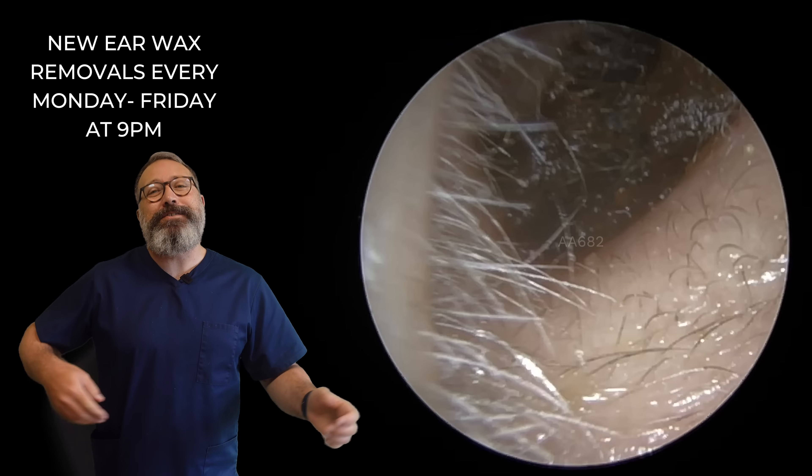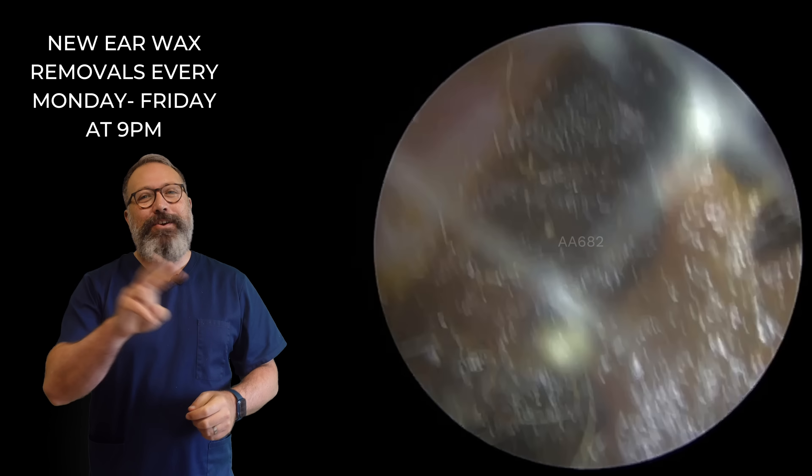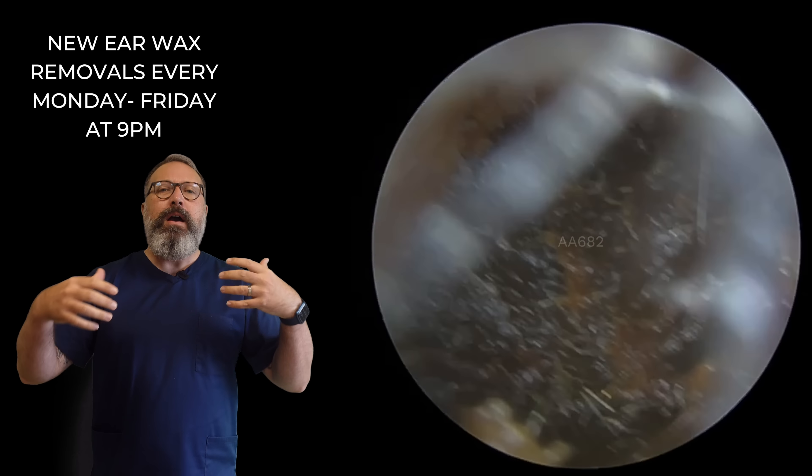Hi everybody, this is Rhys Barber from Audiology Associates. Thanks very much for watching this ear wax from Earville compilation video today. Two patients in this compilation video, both have got very deep wax.